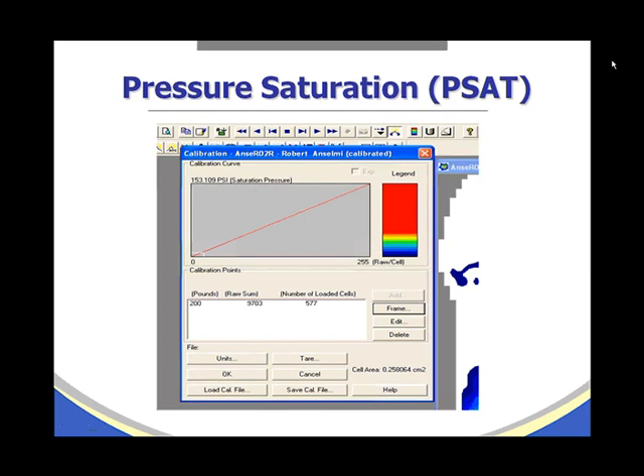Here again is pressure saturation displayed in a different location within the software — inside the calibration window — where it is reporting 153.109 PSI as the saturation pressure.